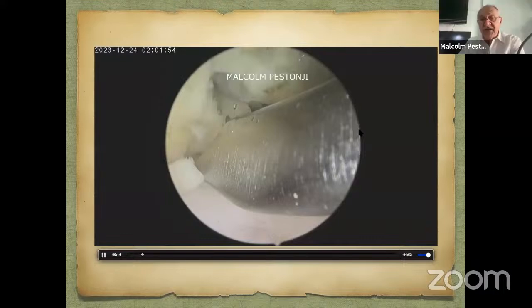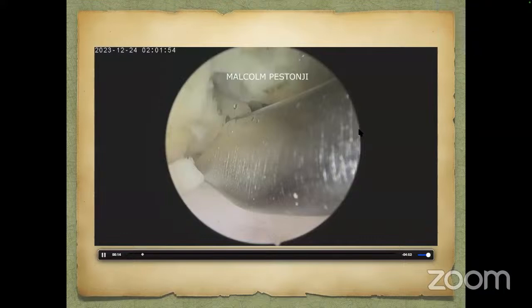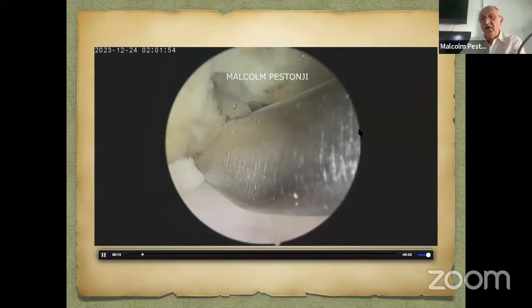Yeah, now the video, I paused it to show you the bony window. Okay, fine. Can you see this? This is the small bony window that has exposed the traversing nerve root, axilla, as well as removed the fragment.